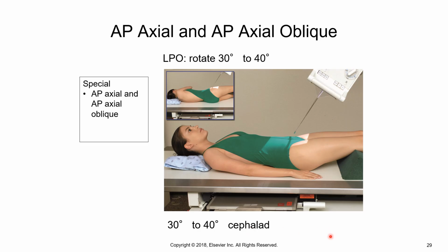So for this particular image on 535, you would be at a 40-inch SID. So these are considered our overhead images. Okay. These overhead images are done after the radiologist leaves the room, and they are done in this order. So you're at a 40-inch SID. You are on a 14 by 17 portrait. Your kVp range is 110 to 125 for single contrast, 90 to 100 for double and water-soluble contrast. So make sure you write these techniques down.